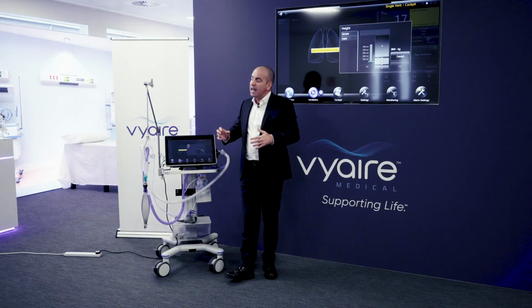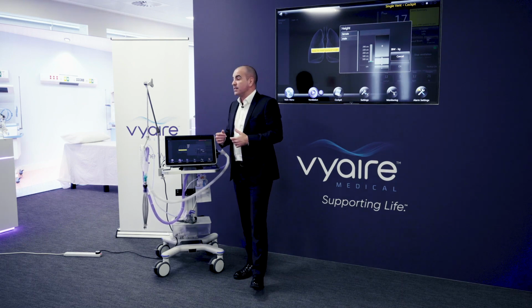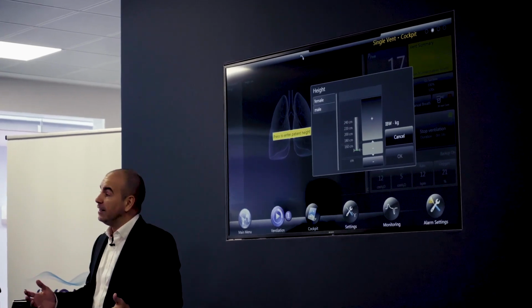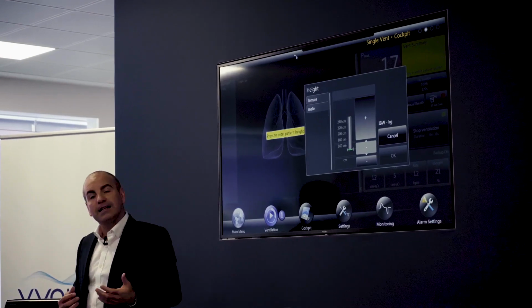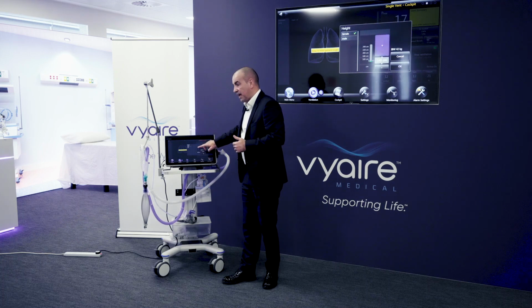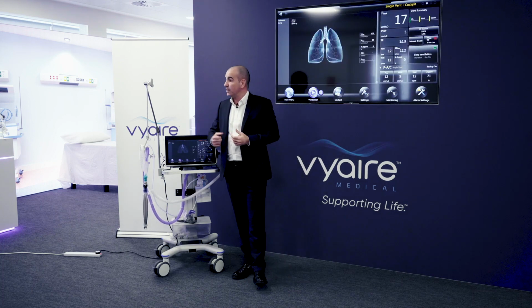We can tailor everything to the patient's ideal body weight. Not their actual body weight, but their ideal body weight. Because, for instance, if you were to go to the US and you were to eat McDonald's breakfast, lunch, and dinner for 6 months and you came back a little more portly than when you went there, your lungs have not changed. So the clinical guidelines tie everything back to your ideal body weight. And this is what we would do here. So we'd have maybe a female of X number of centimeters, and it calculates what the predicted body weight is. Okay, so it's tailored to the individual.